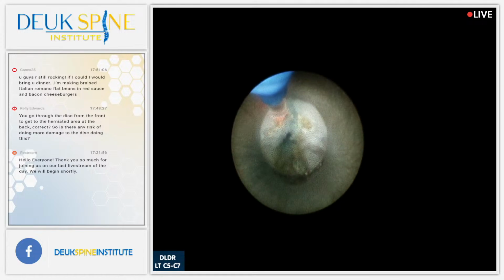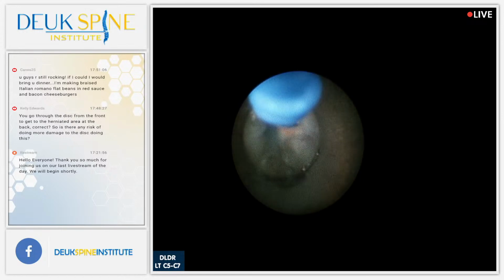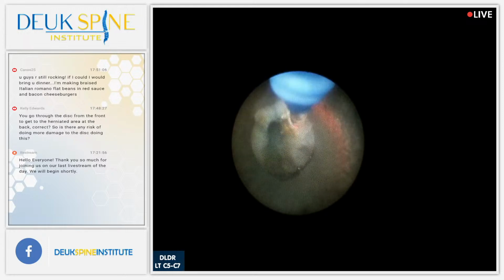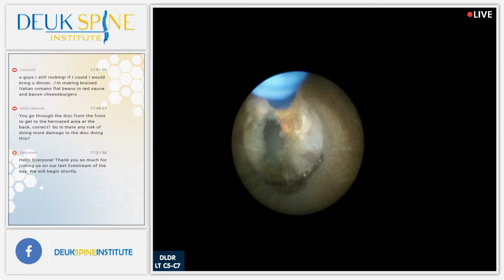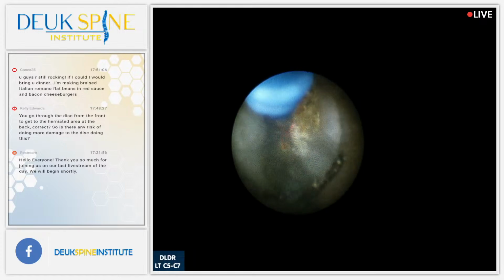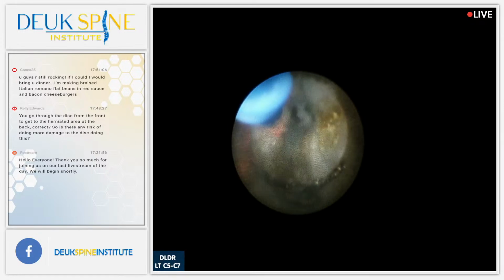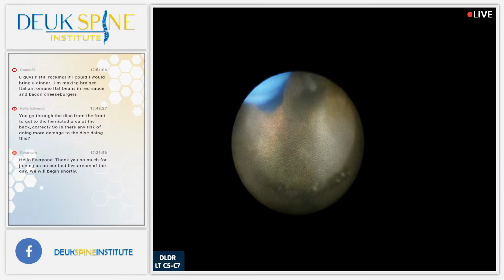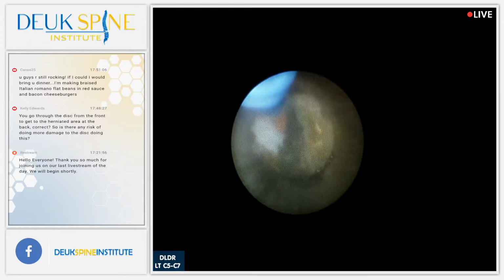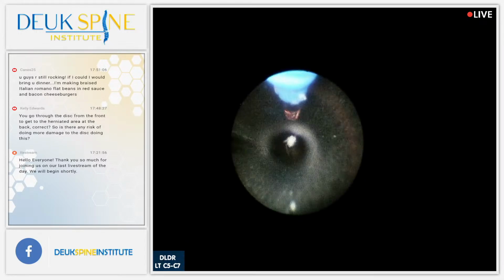A lot of scar tissue here. See all that orange stuff? That's calcium inside the scar tissue. That orange stuff is not normally there. It's abnormal. It shouldn't be there. It's only there because the body responds to excessive inflammation by forming excessive scar tissue. And the excessive scar tissue, of course, gets calcified in a process called dystrophic calcification. Look at all those little pieces coming out of the foramen.